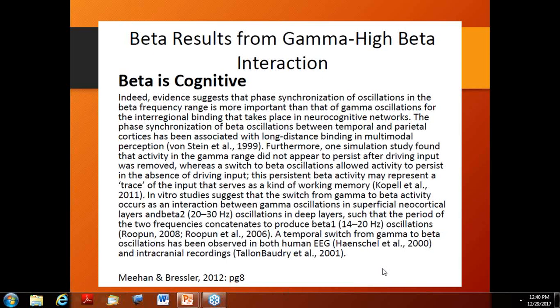You may have an area that is producing a lot of glutamate, right? And what if that area is particularly on the left side, because it's worry? That area might be overwhelmed, and so it might start pulling from the right hemisphere. And so now you have both areas heating up, and then you'd have increased coherence measures on your map. As far as I can see in the literature, that's really what we're looking at: resource allocation when we look at coherence. One area's pulling resources from another area in order to manage a process.